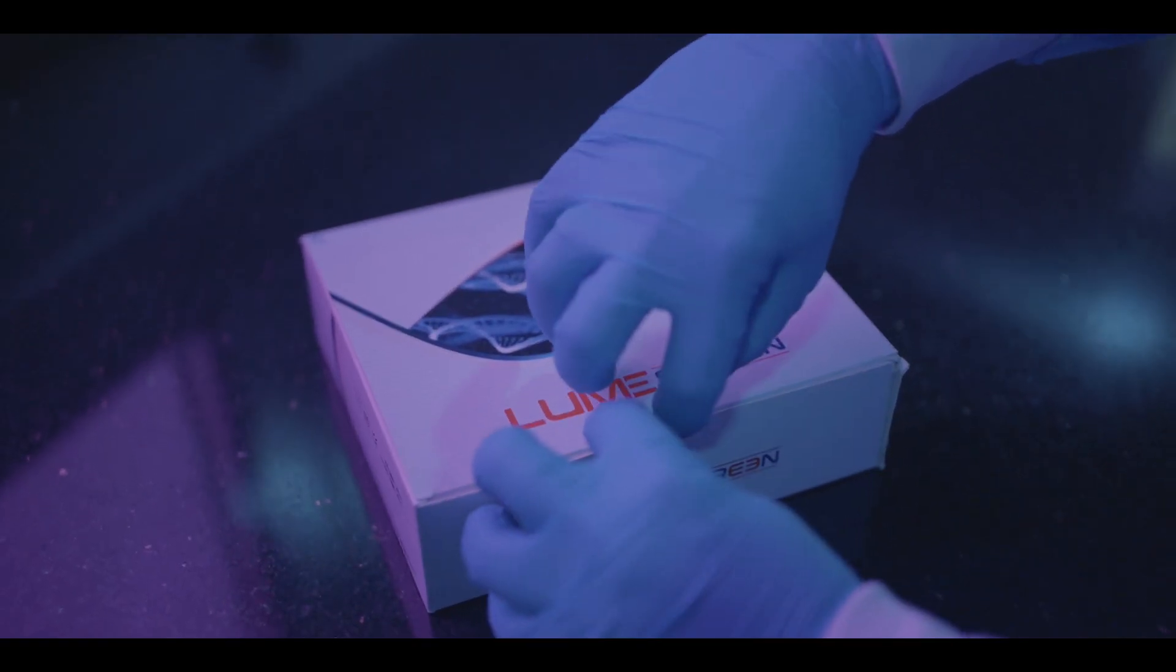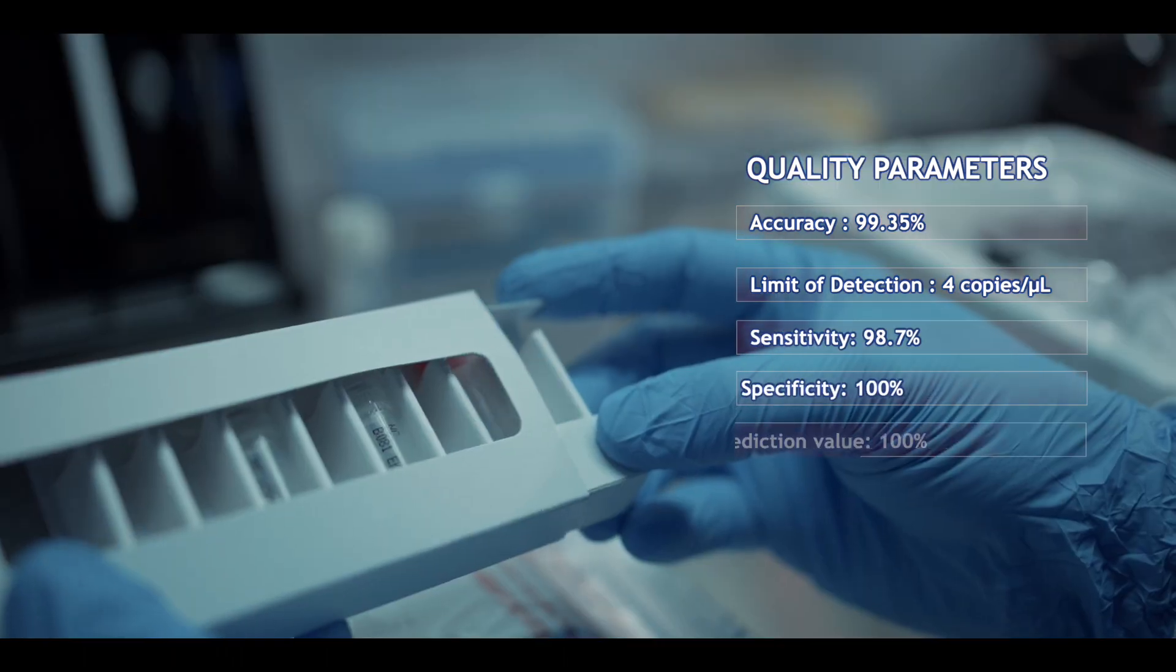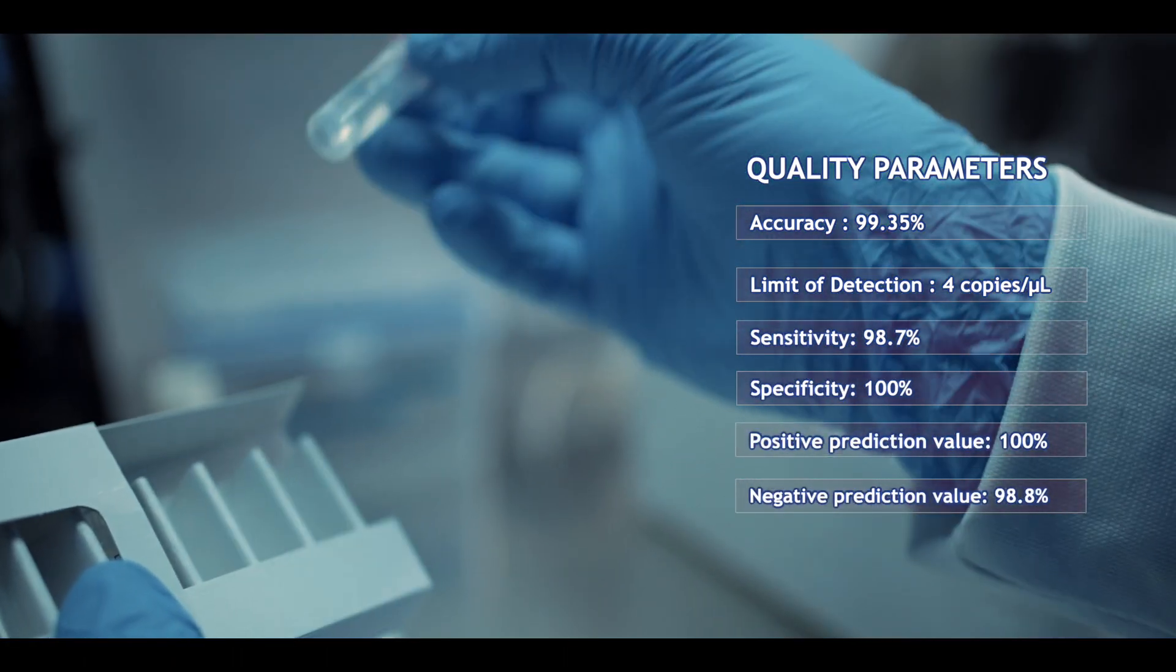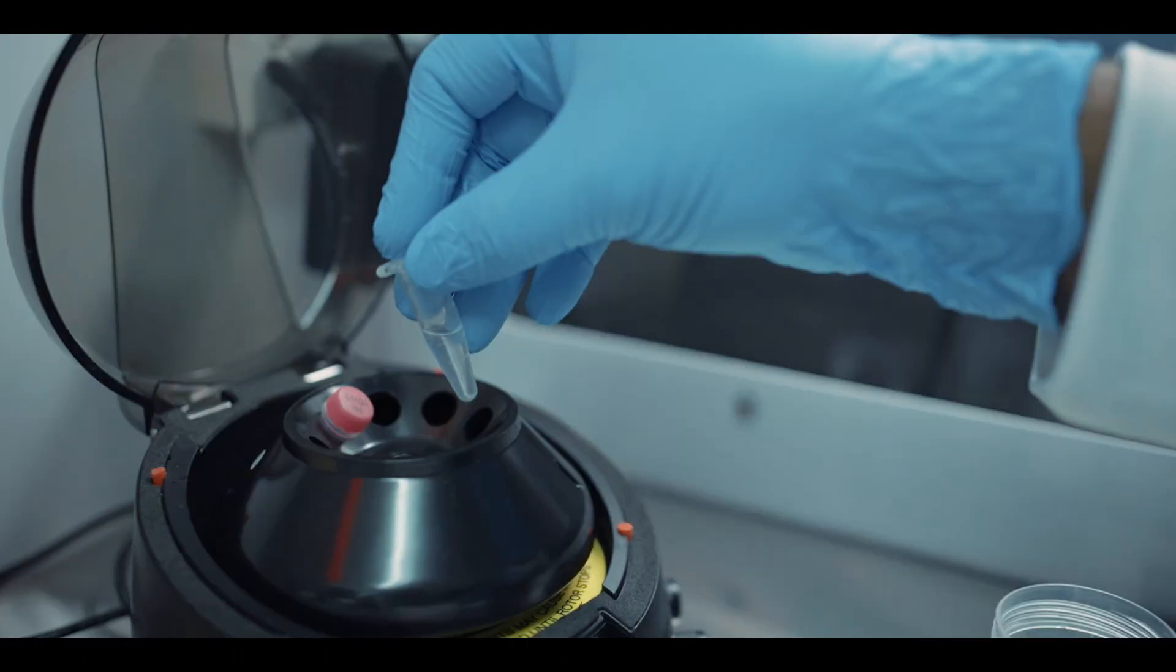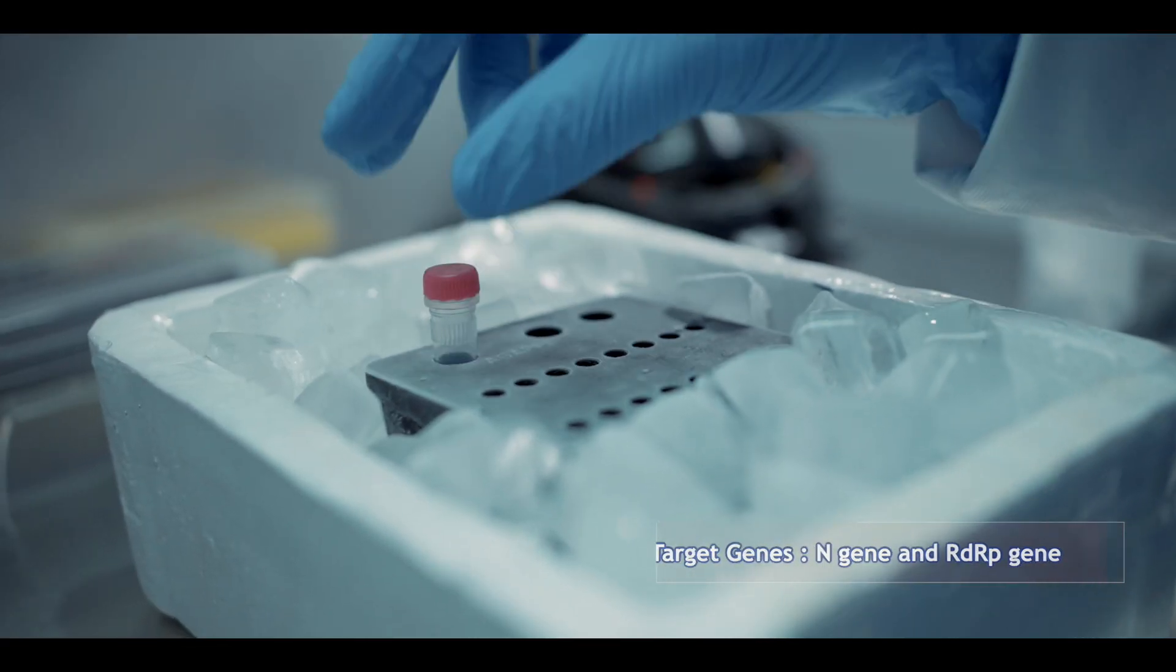With a very high accuracy of 99.35%, LoomScreen guides the medical fraternity better in COVID diagnosis. Primers are designed by targeting N genes and RDRP gene respectively.